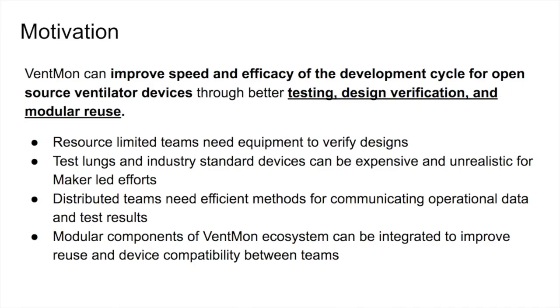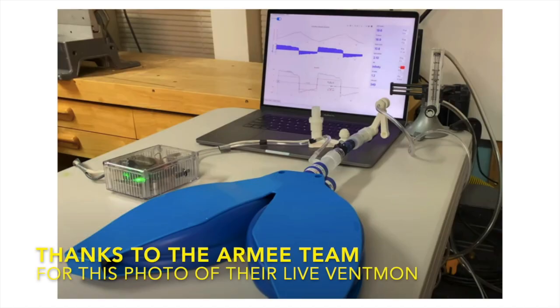Finally, as I mentioned, our goal throughout this process has been to promote the modularity of the components in our device and help demonstrate that these modular ideas can be integrated to ultimately improve reuse and compatibility between design teams in this space. So here's just a quick picture of the VentMon in action.